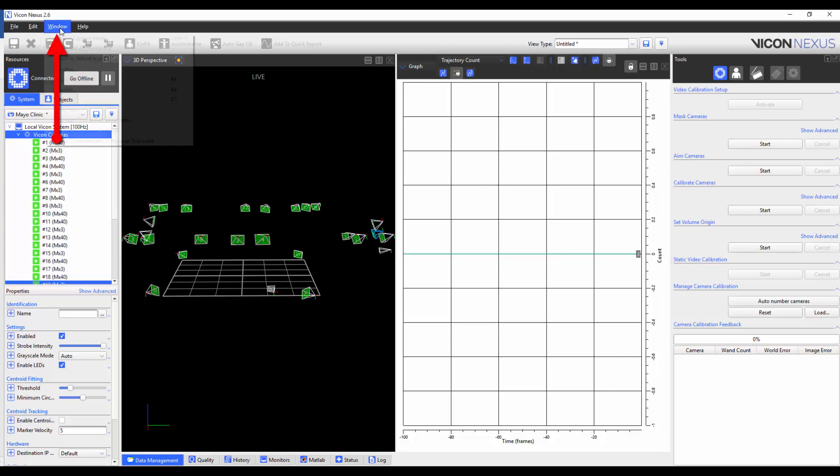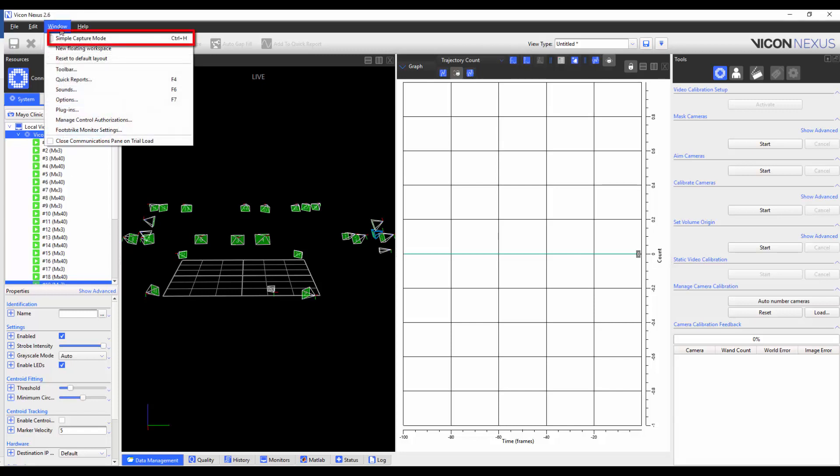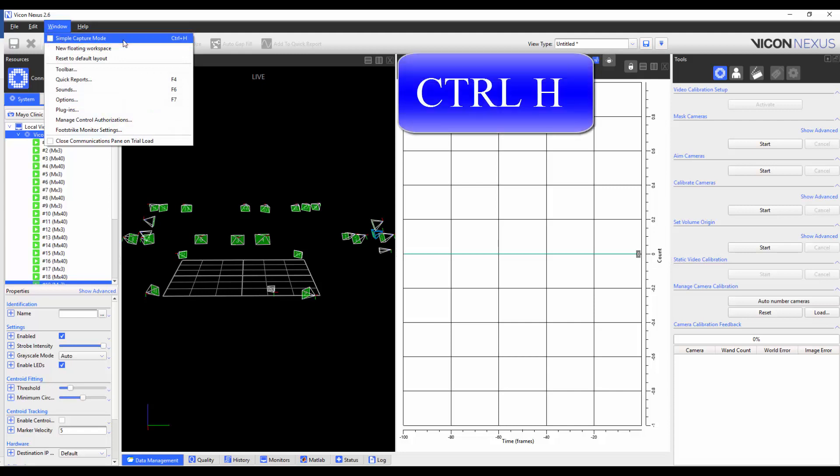To access the Simple Capture Mode, go to Window, and select Simple Capture Mode. Alternately, you can press Ctrl H on the keyboard.